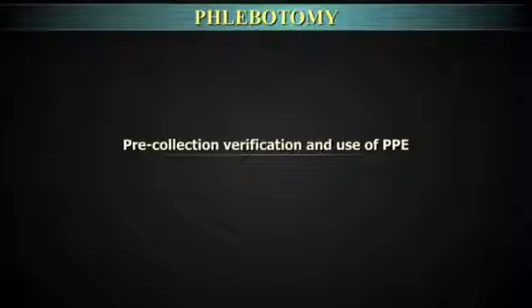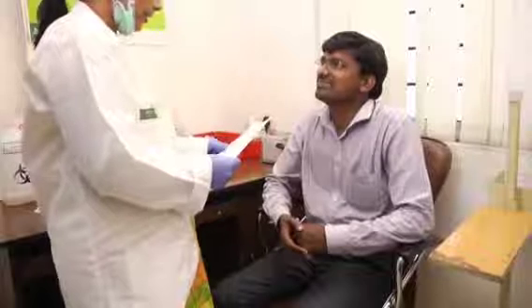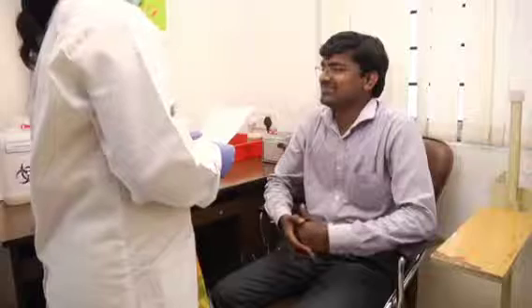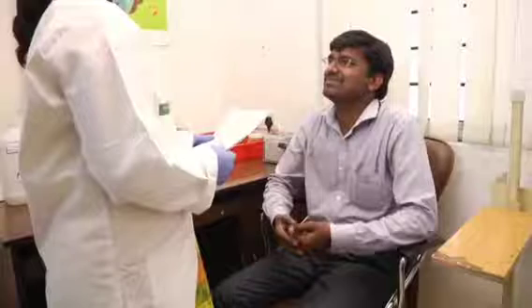Pre-collection verification and use of personal protective equipment. Approach the patient in a calm, confident, and professional manner. The phlebotomist must gain the patient's confidence. Assure the patient that, although the venipuncture will be slightly painful, it will be short in duration and necessary for the diagnosis and treatment of their healthcare problem. Answer any patient query related to laboratory procedure.